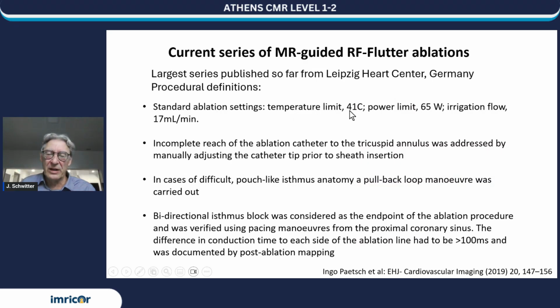The temperature limit was 41 degrees. So the ablation catheter can also measure the temperature. And if the temperature exceeds a certain limit, it stops the RF injection into the tissue. It can go up to 65 watts. So in this current trial, which is a multi-center trial done by Imricor, we go up to 50 watts, but the machine can go up to 65 watts.